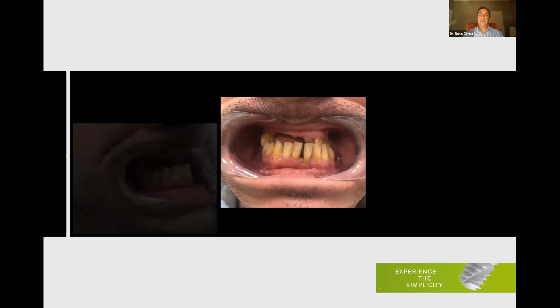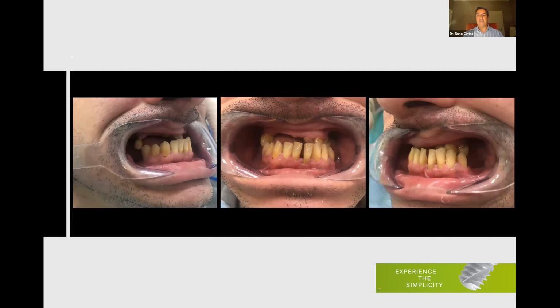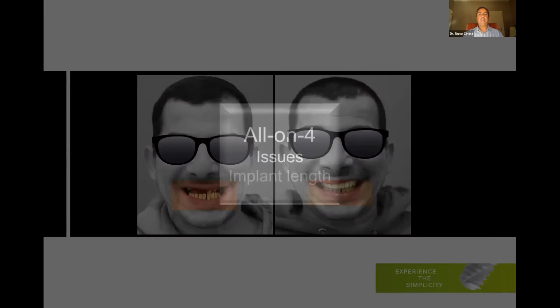Another case, look at this case. How are we going to correct this? Of course, we have to place the implants higher so we can gain space for the prosthesis, and we can gain space for the lip support. So we can go from this to this on the same day. But for that, of course, we need to reduce bone. Of course, we need to place our implants in a higher position, in a much higher position. From this to this on the same day, after bone reduction, of course.